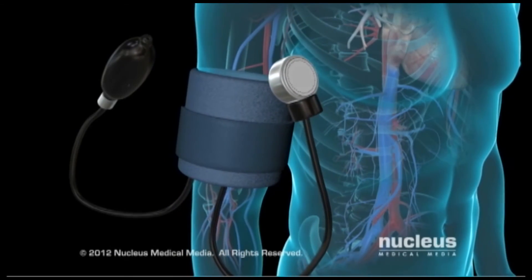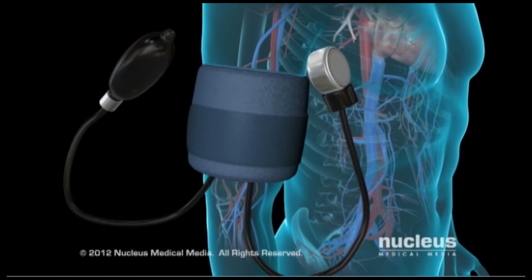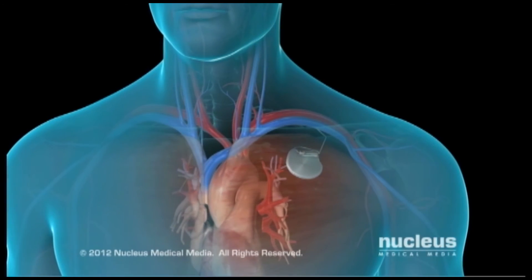While you're in the hospital, your doctor will monitor your heart rate and blood pressure to be certain the pacemaker is working properly. Before you leave, he or she will make final adjustments to the pacemaker settings.